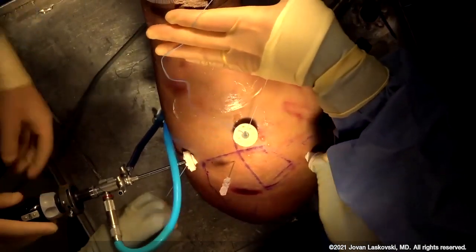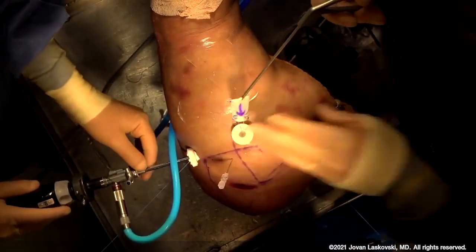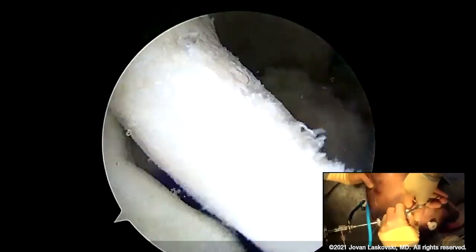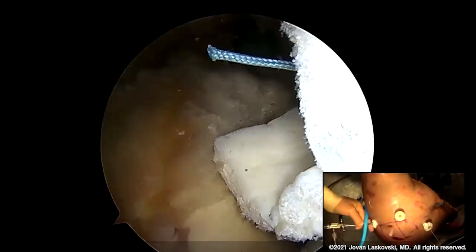I found it's actually really convenient to leave a wick of suture coming off the knot stack itself. We're going to fold this thing up like a Los Angeles taco, and that'll ensure easier passage through the graft. We're not rushing here — this is the pain point of the procedure. We want to make sure that this comes in smoothly and works really well.